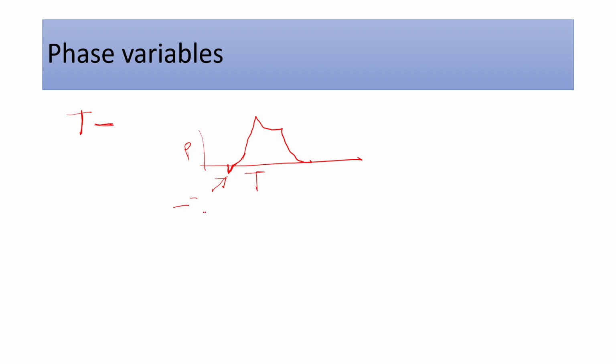So that is -2 centimeter of water if I keep it on a ventilator, and if the patient generates -2, the flow will be generated, and this is the pressure trigger. The next trigger which you can keep, which in studies has been shown to cause less work of breathing, is a flow trigger, where you can keep a flow of 5 liters per minute in the circuit. If a flow is detected, the machine senses that inspiration is required, and the inspiratory valve opens, and the patient gets the breath.